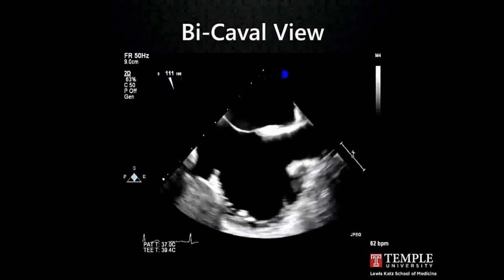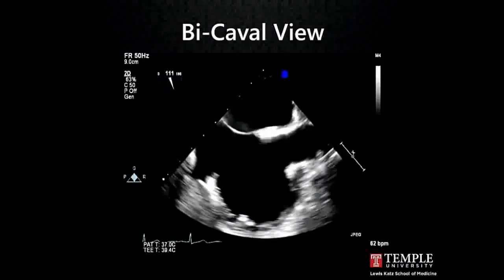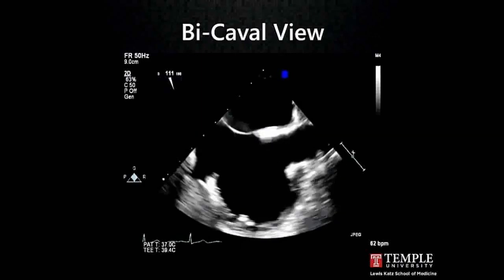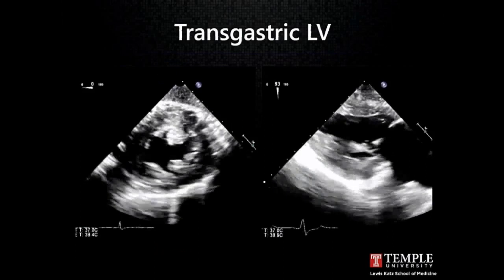And then up at 10, 11 o'clock is the os of the coronary sinus as it wraps the left AV groove, because that's the left atrium at the top of the image. So these are standard TE images in the standard anatomy.